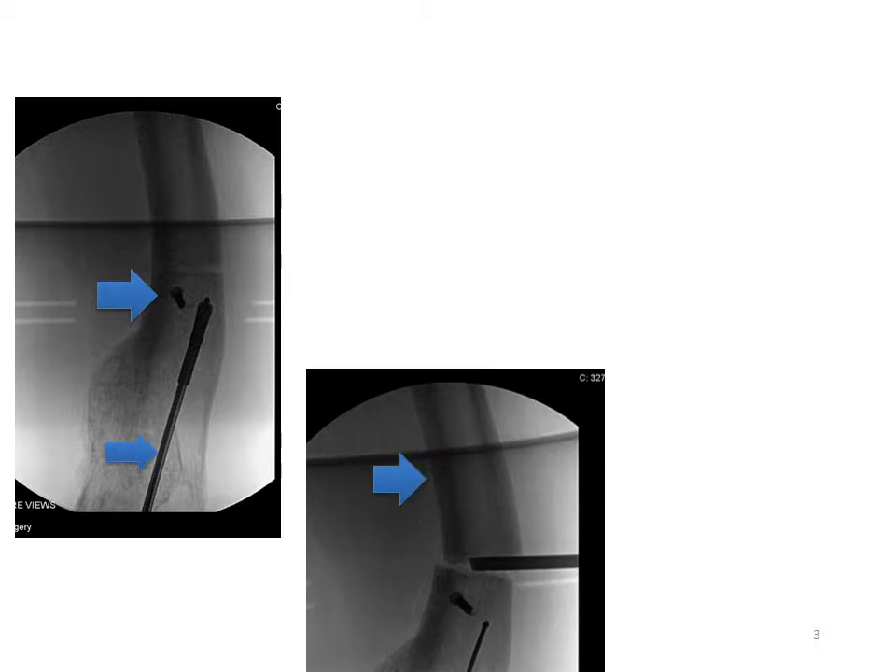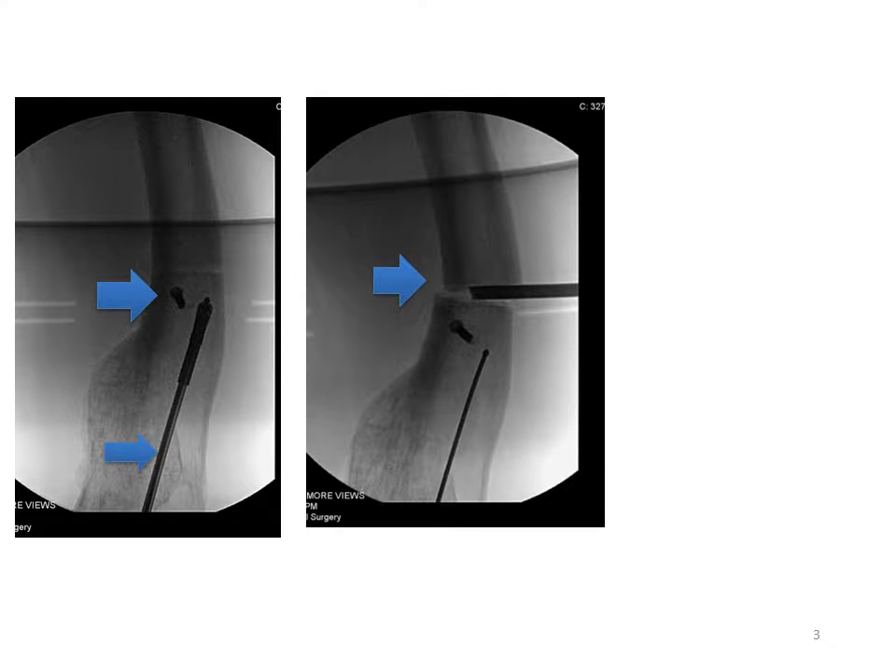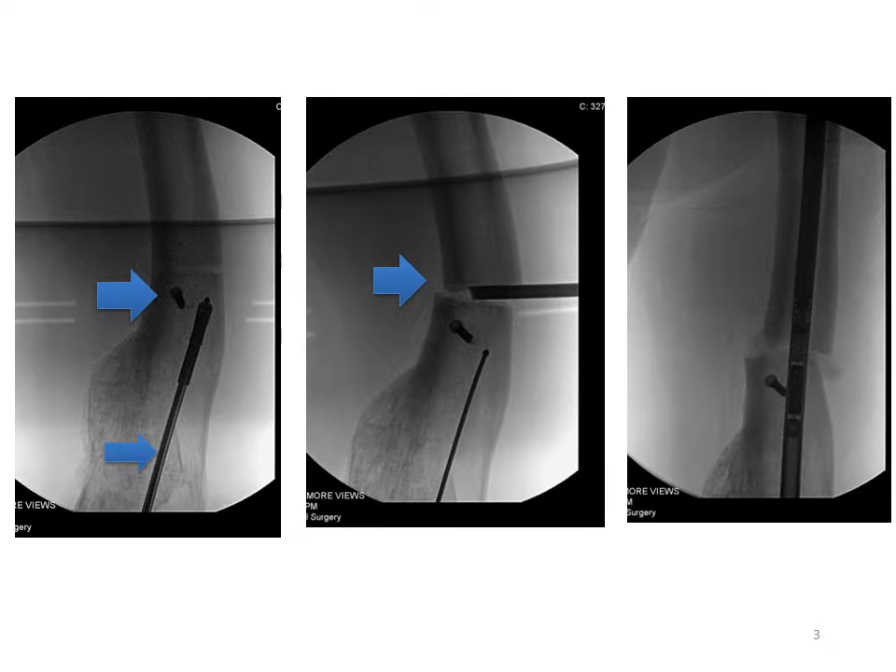In surgery, you can see some of the steps. We use a blocking screw, which helps us optimize the deformity correction. There's a retrograde nailing technique. The osteotomy is performed at the apex of the deformity, and then the nail is passed in a retrograde fashion, straightening the bone.